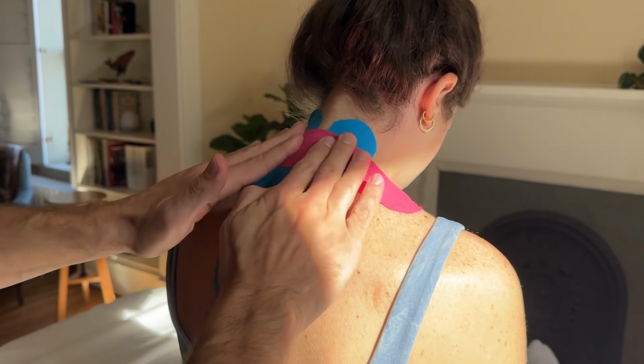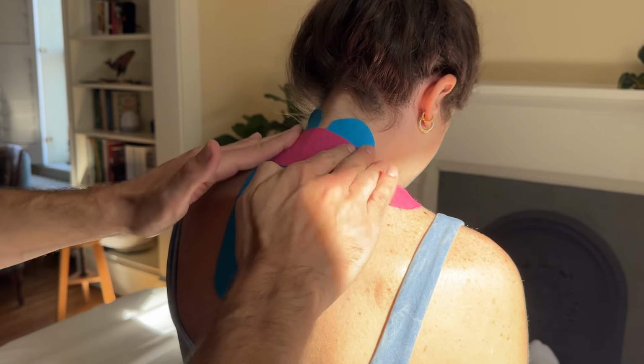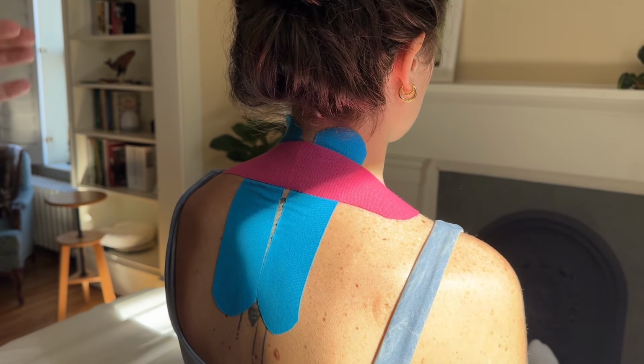Get the client to come back into extension. You should see a little bit of wrinkling in the tape. And ask them if there's any discomfort or how they're feeling. And usually they're going to say they feel stabilized.